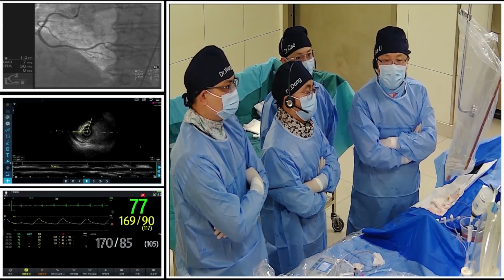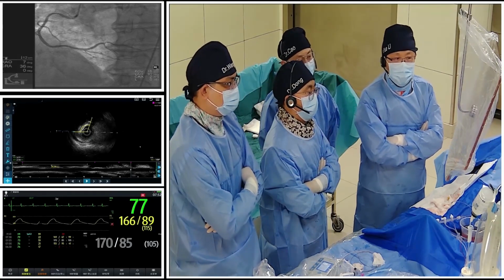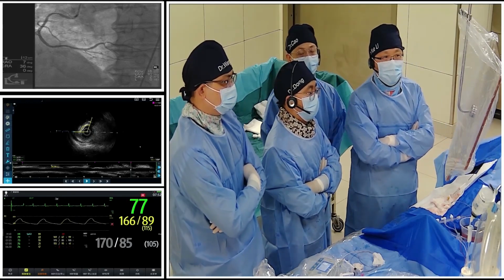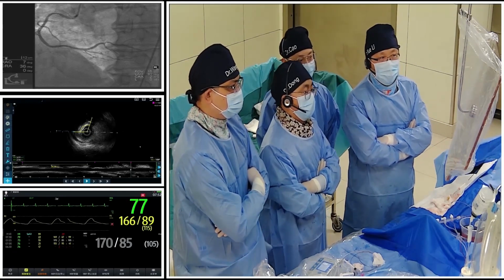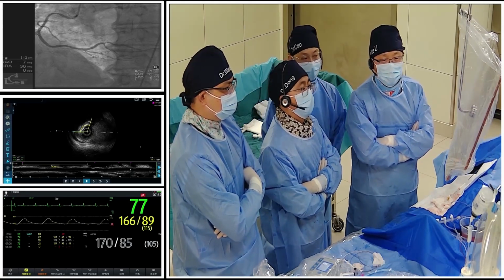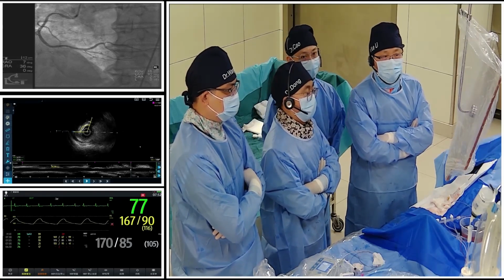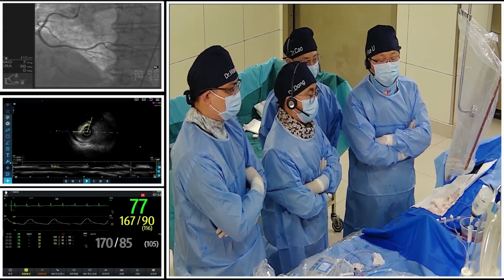I am Dr. Cao Yang from the Cardiovascular Department. I am privileged to be the moderator of the current operation through MedStream 360 to demonstrate our theory and techniques in our daily PCI work. I hope each and every one of you will enjoy the following unique calcified case.